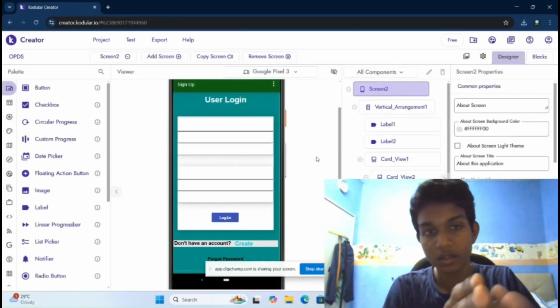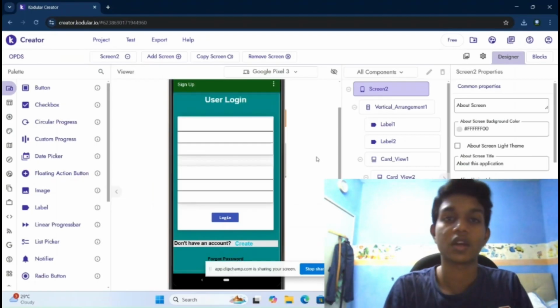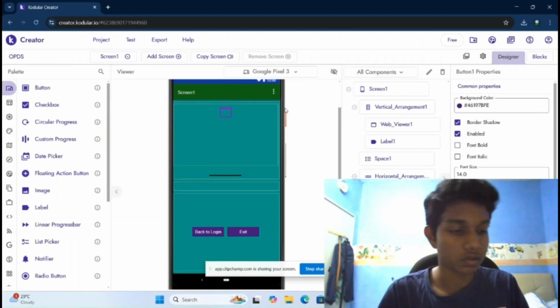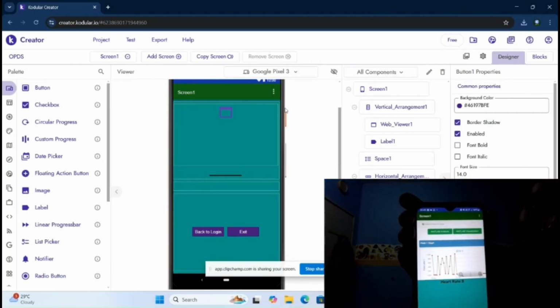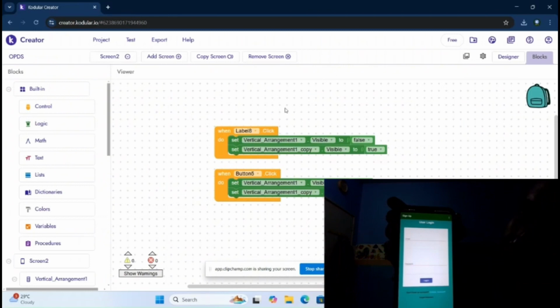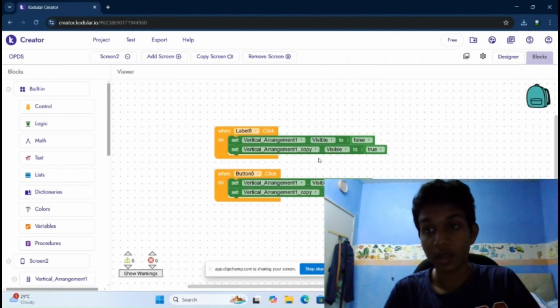In our app, we have a basic system where users log in, and the login system gives doctors their authorization, so no one other than them can log into the system. Once they go in the system, they have their own screen and display outputs. So this is how our app looks in real terms. You see the graph will be displayed on the screen, and they also have the interface to go back to login and to their system. So basically this is how we track and get our data to our app.